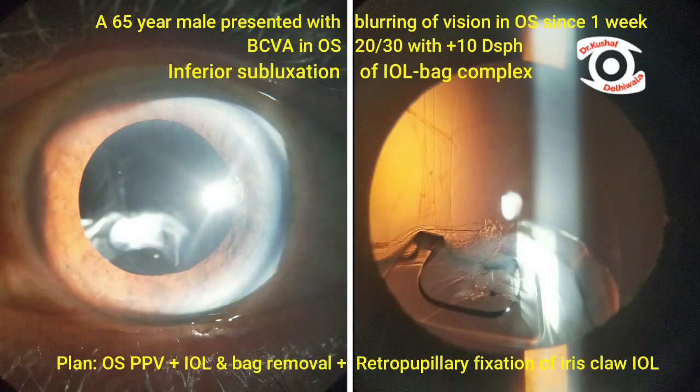A 65-year-old male presented with blurring of vision in the left eye since one week. BCVA was 20/30 with plus 10 diopter. Slit lamp evaluation showed inferior subluxated IOL-bag complex. Pars plana vitrectomy with IOL-bag removal and retro-fixated iris claw lens was planned.